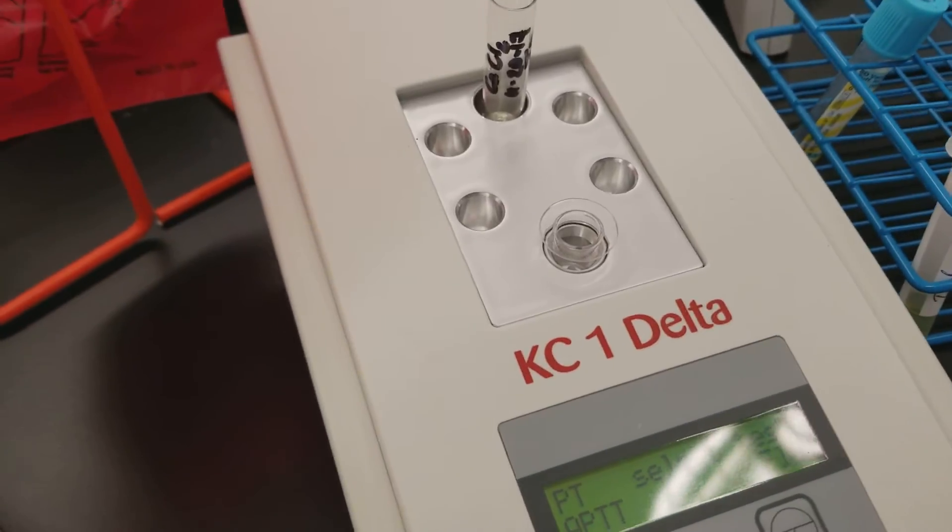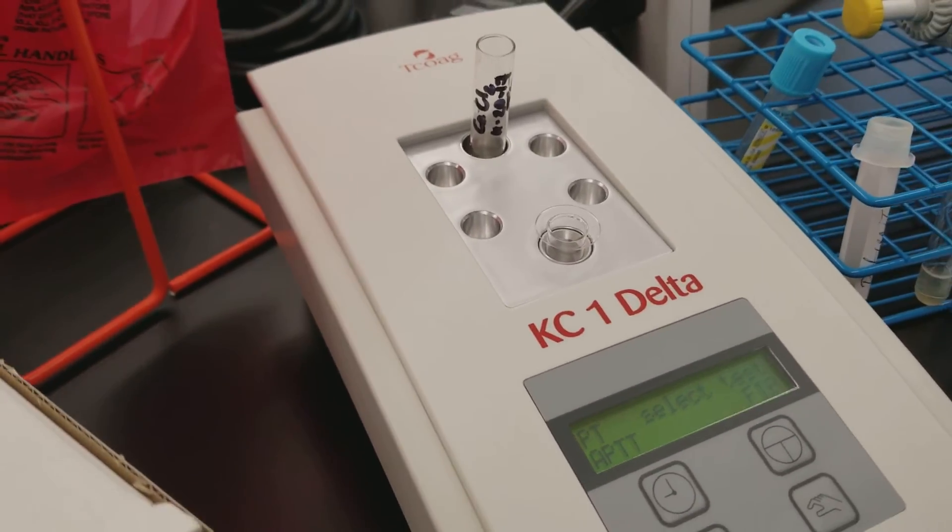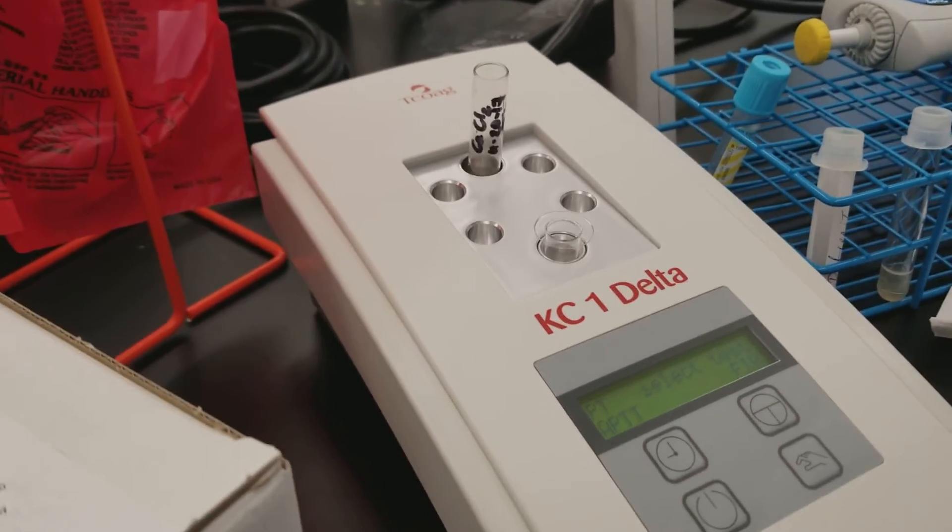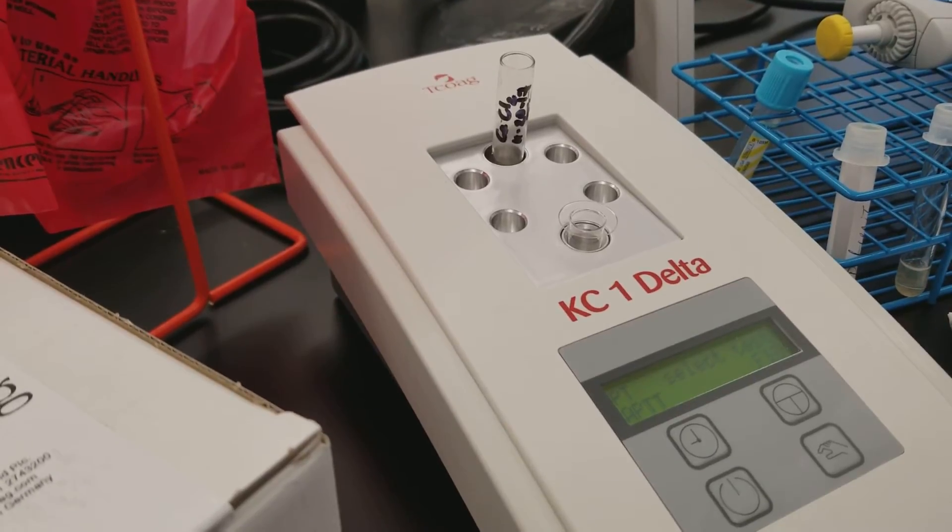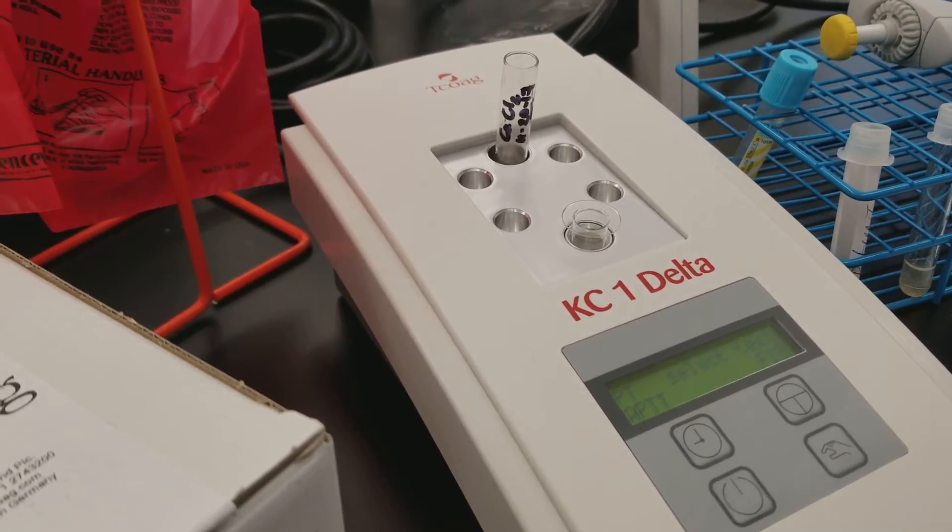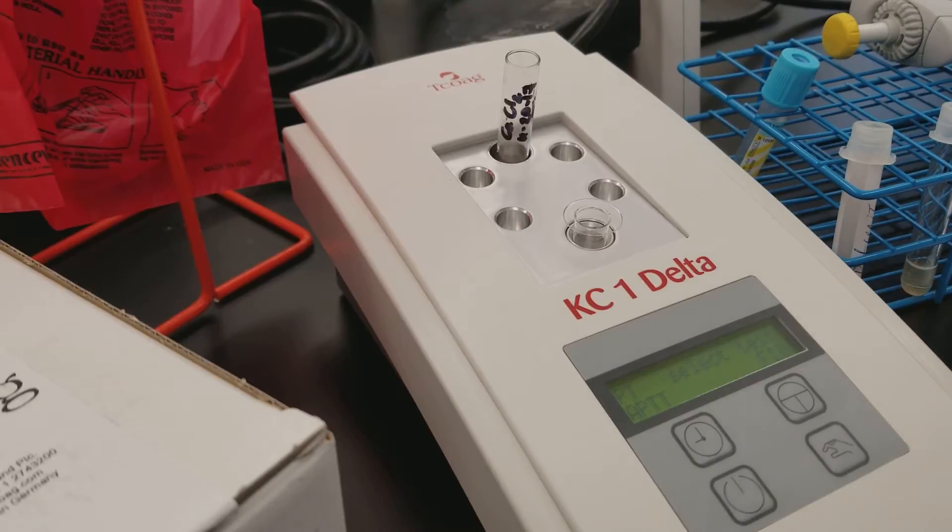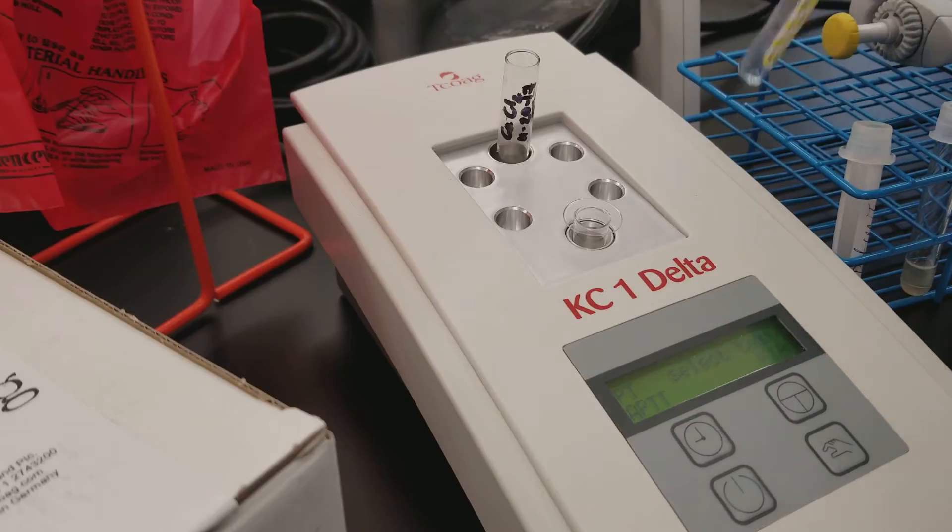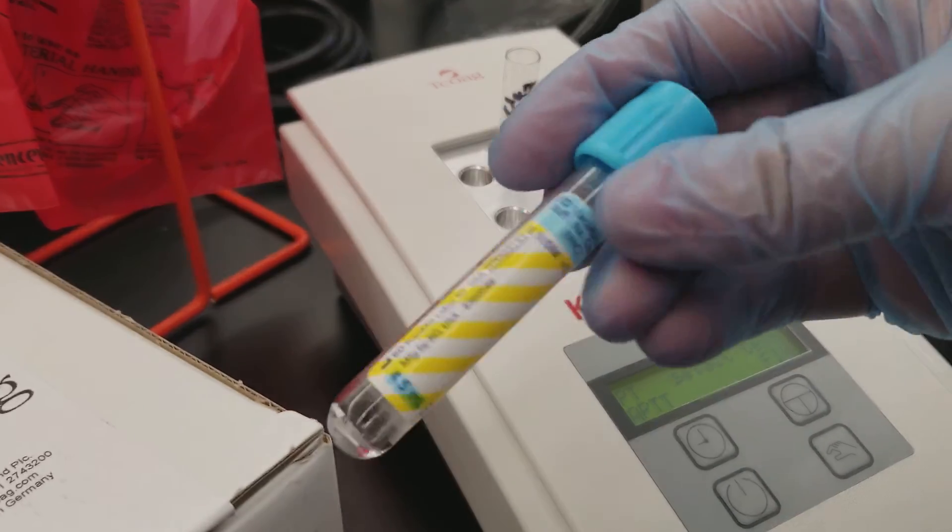So the two types of testing that I'm doing today are the PT, the prothrombin time, and the activated partial thromboplastin time, which is the PTT. So with that, we have two reagents that we use with the PTT, and it's due to how the specimen tube actually works.